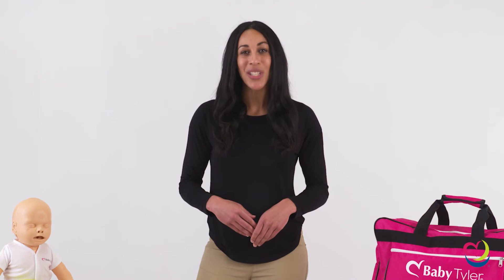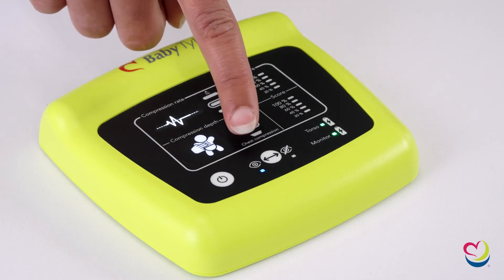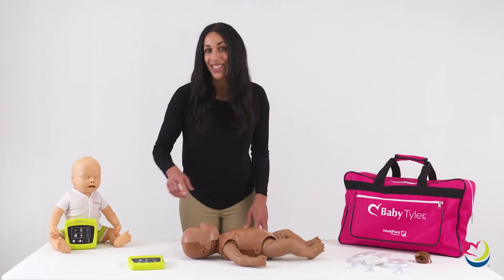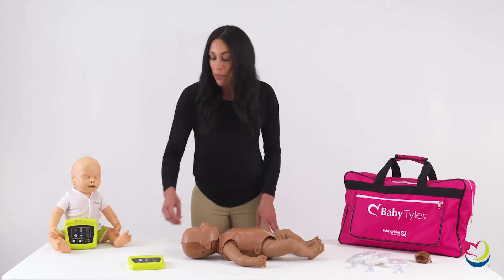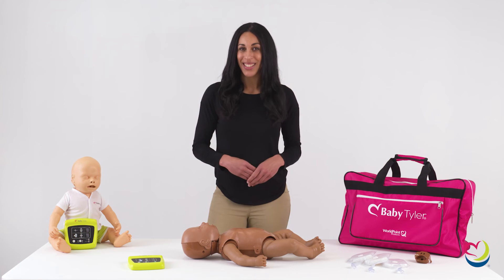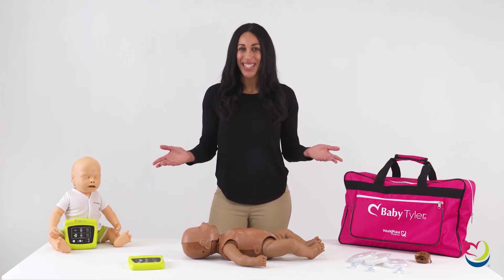Selecting the training mode is easy. At the bottom of the CPR monitor there are two symbols: an open eye for standard mode and an eye with a line through it for blind mode. To select the mode, simply tap the button until you get a steady light in your preferred option, standard or blind. Once you have selected your preferred training mode, it's time to get to CPR.